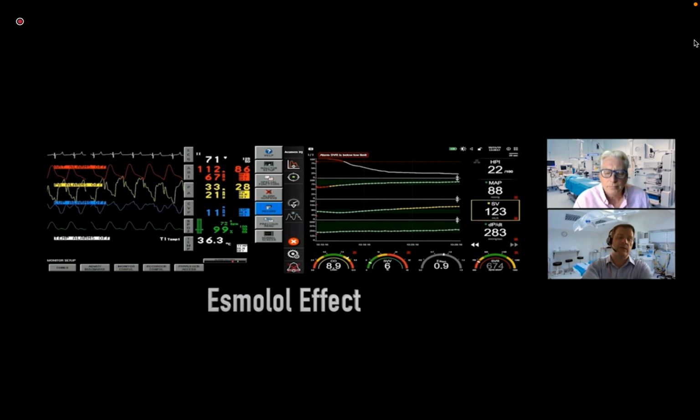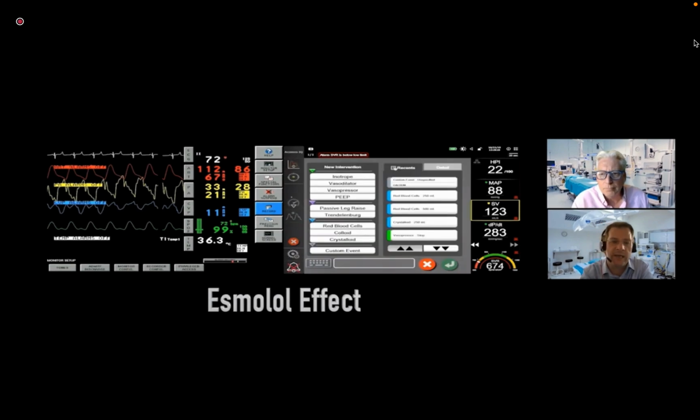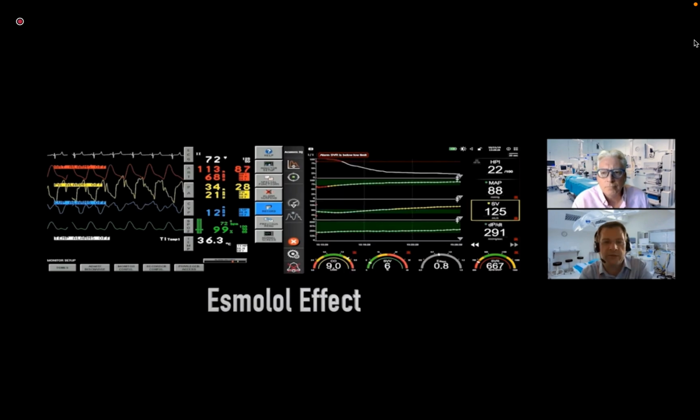So in this section of the virtual physiology lab, we're looking at contractility via dP/dt. And firstly, we're looking at the effects of an esmolol bolus on contractility. Esmolol is a beta blocker and does have some negative inotropic and chronotropic properties. Just to reorientate ourselves, the screen setup is very similar to our last part of the virtual physiology lab, except our bottom trend has changed from SVV to dP/dt. That is change in pressure over change in time, which is a surrogate for our left ventricular contractility.